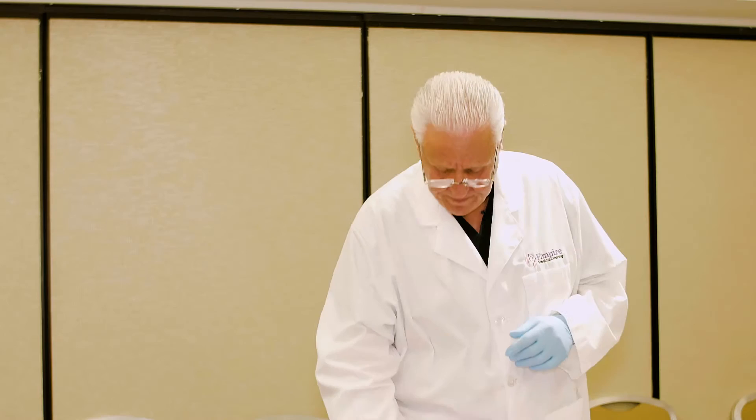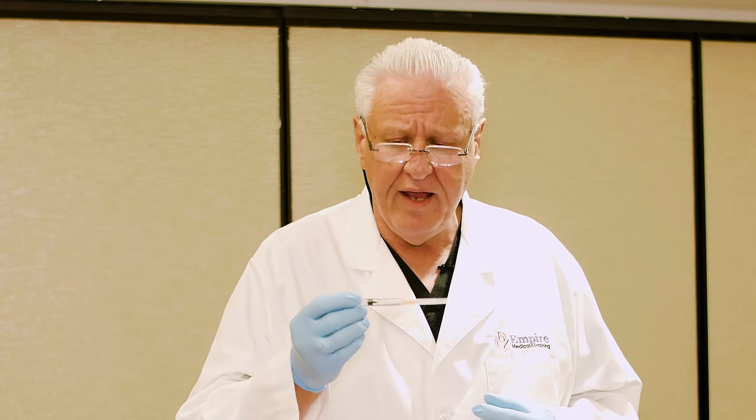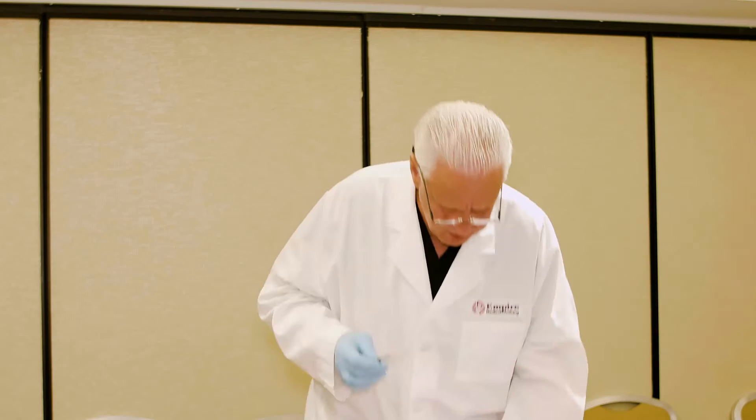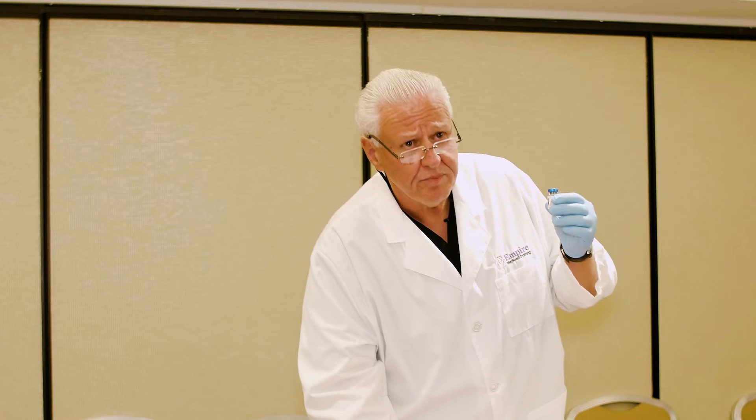This demonstration is going to show you the correct — or FDA and manufacturer's — recommendation for reconstitution of a vial of neuromuscular blocking agents. The reconstitution rate according to the manufacturer and the FDA is 2.5 ml of normal saline, sodium chloride, into a vial of 100 units of neuromuscular blocking agents.